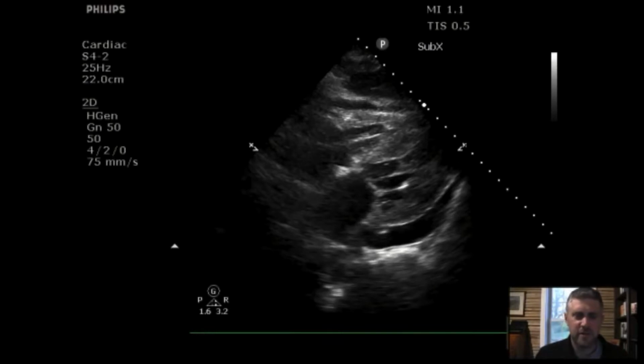And so here's an example of collected fluid in that pericardial space. And you see there's a thin layer on top, right? But there's that bigger area in the dependent aspect of that pericardial sac. And that's really what we're looking for right there.